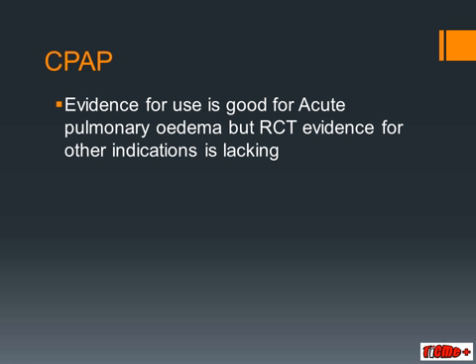Okay, so we've talked about bi-level non-invasive ventilation. Let's now talk about continuous positive airway pressure. CPAP has got very strong evidence associated with its use in acute pulmonary edema, but unfortunately randomized controlled trial evidence for other indications is lacking.